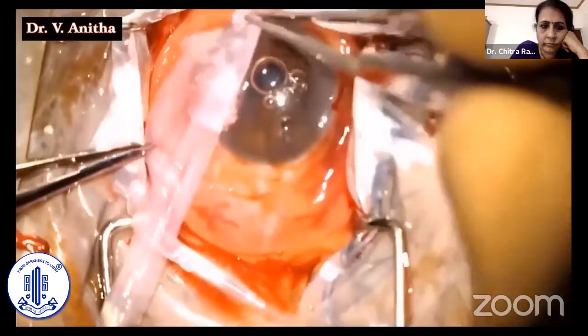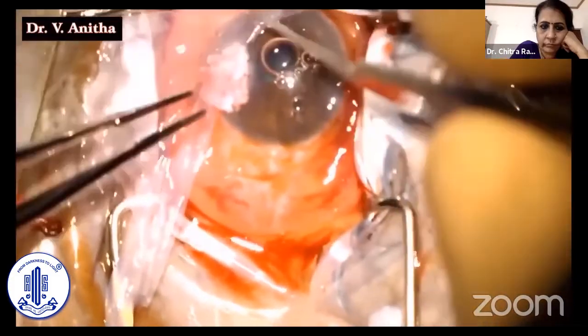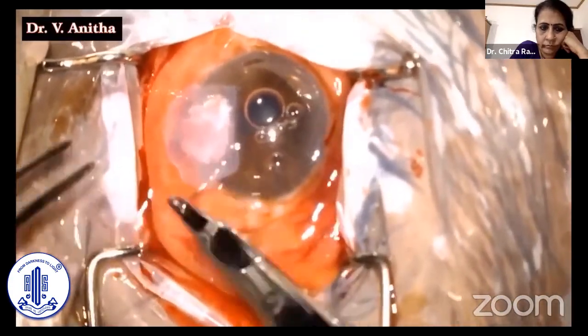Amniotic membrane was covered over the Tenon's to promote epithelization, and was also secured with 10-0 nylon sutures.